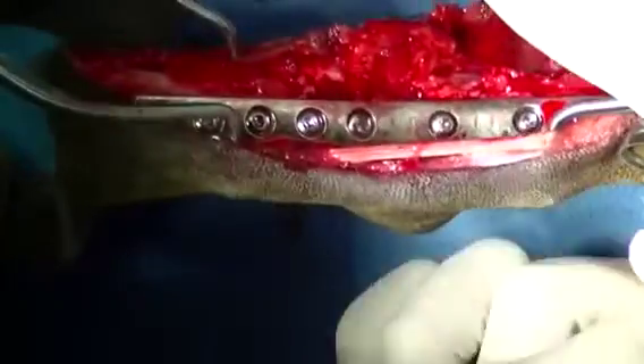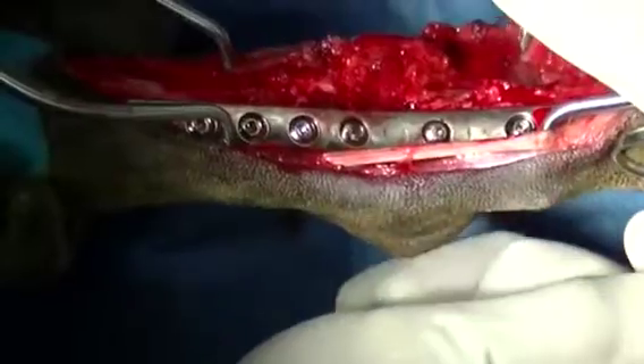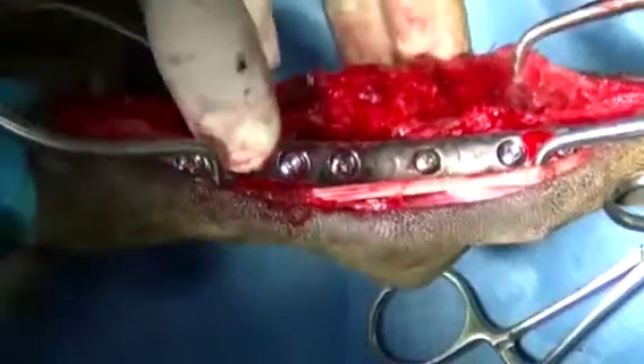Here we can see the bone graft which is being harvested from the proximal tibia being packed into the exposed bone surfaces after the cartilage has been removed.